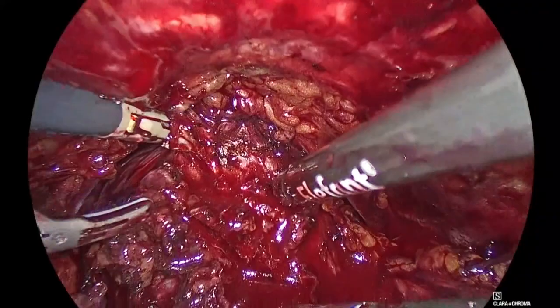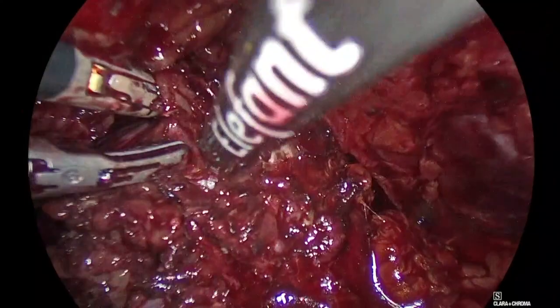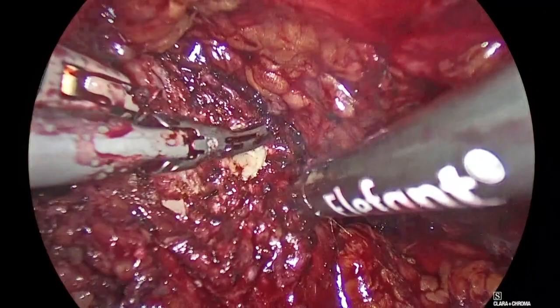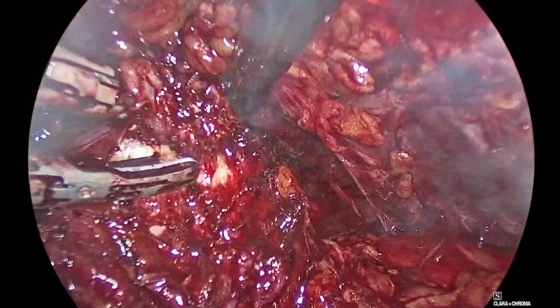There. Come centrally. Good. Other side, Panayuti, there. Show me. Good. Put the gas to 20, please. Pull the prostate, Panayuti. I need length. Length on the prostate. Evangelos, do you think that harmonic is enough to close the Santorini plexus? No, at the end of the procedure, you make the stitches. Of course, stitches. Harmonic is not enough. If I leave my grasper on the right side, now that is putting pressure there, you will get a lot of bleeding.